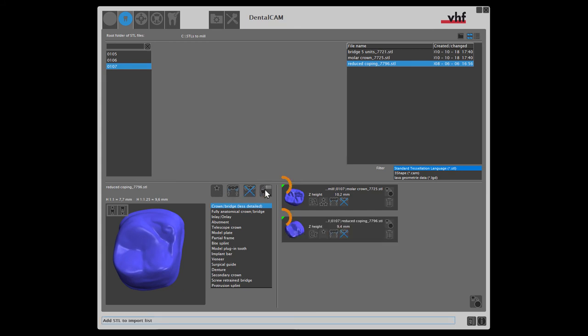The green indicators tell us that the height of our disk is sufficient for the height of the crowns. If one of the indicators displayed in red, we would simply go back to the blank archive and create a blank with a suitable height.